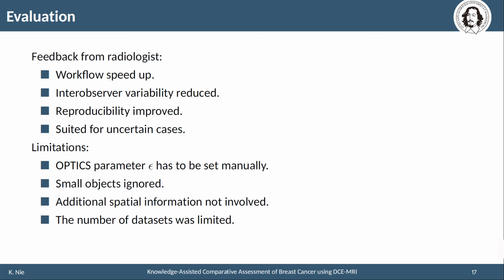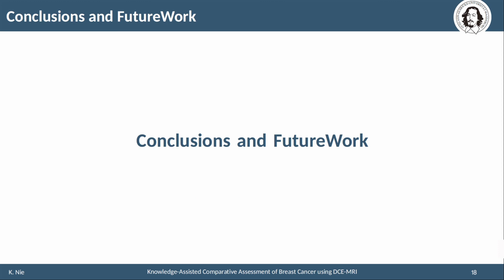Here are some limitations of our approach. First, the OPTICS parameter epsilon has to be set manually. Second, small objects are ignored in our segmentation process. Third, some spatial information such as morphology and textures is not involved. Fourth, the number of datasets we used was limited.